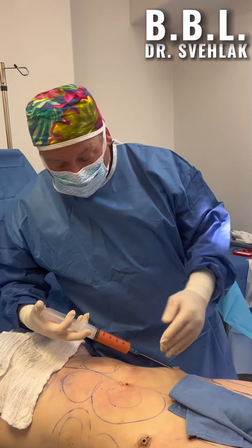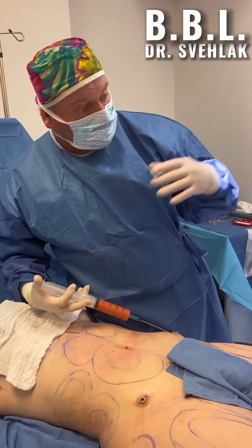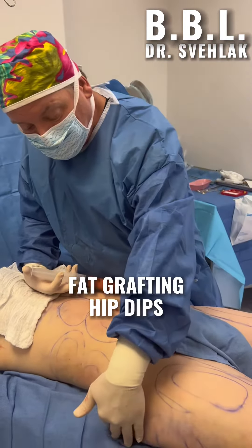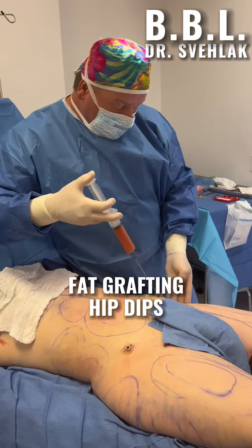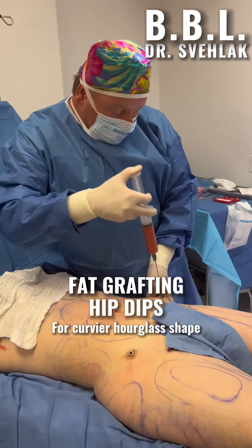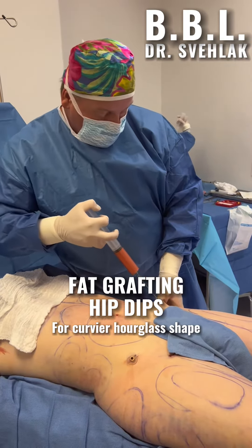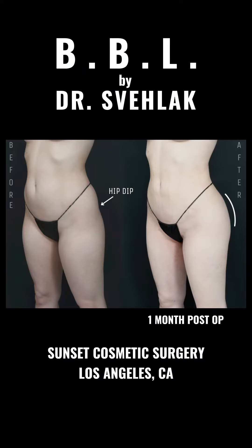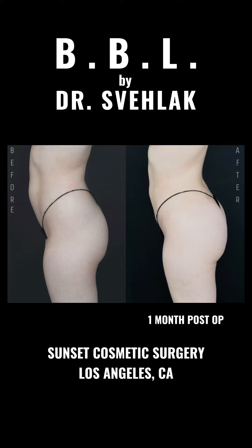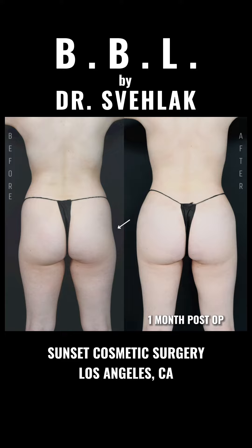What I'm finishing here — we've done lipo on the thighs and the tummy, and processed that fat. Now I'm going to finish up the hip dips on the lateral parts on both sides. I'm doing that right now on the left — give her more curve, give her more fullness in the hips, get rid of that hollow.